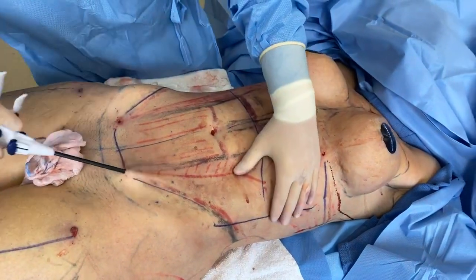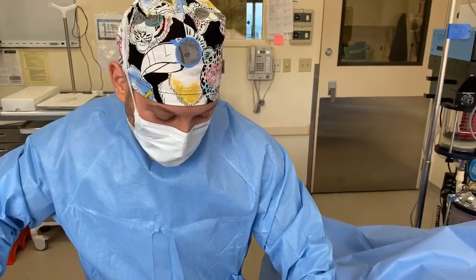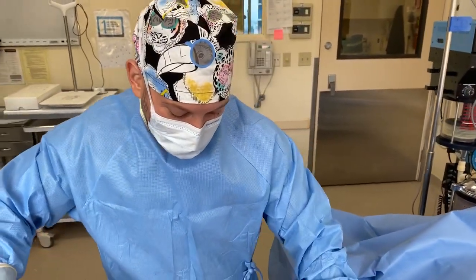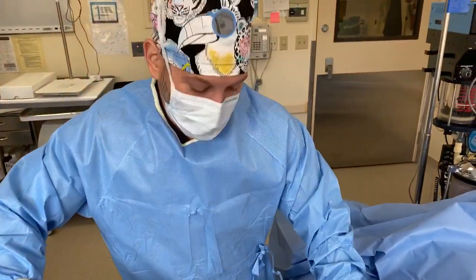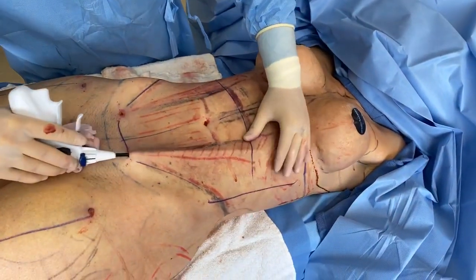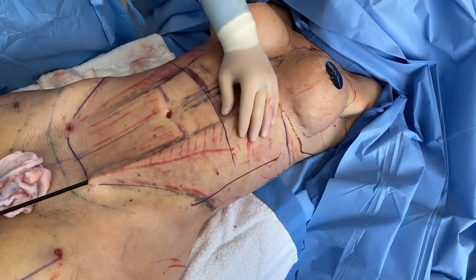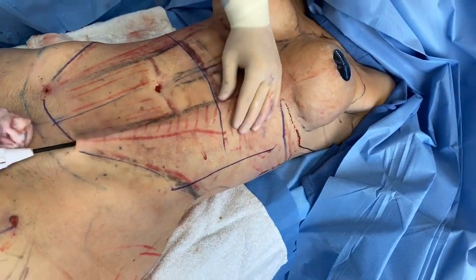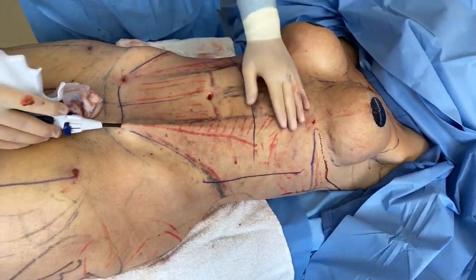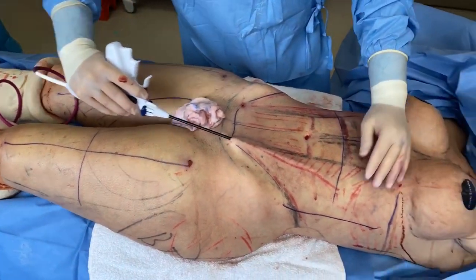I always tell people: when I do body work on you, you commission me like an artist. You commission me to make a painting for you — I'm not a copycat and I don't do replicas. Every case is a commissioned, individual approach. In this case, we're doing a lot of unique techniques to get her the best results. This is also a revision on her legs, making it much more difficult, but the goal is improvement.